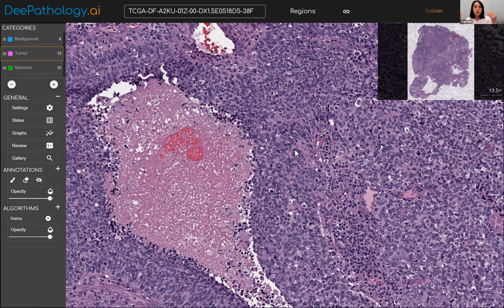So we don't want our AI solutions only to work. We really want to understand the mechanism, how the AI solution has come to the decision it has made. And this can really give us some fantastic insights. So one initial but useful parameter would be that of heat maps or probability maps.